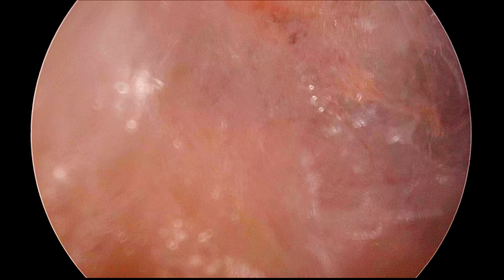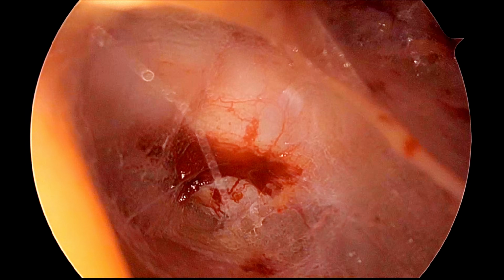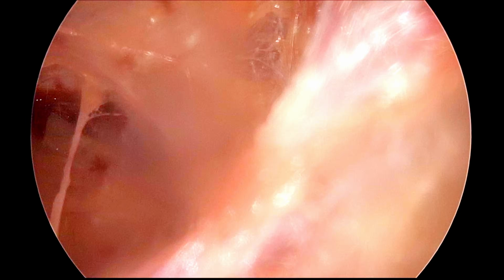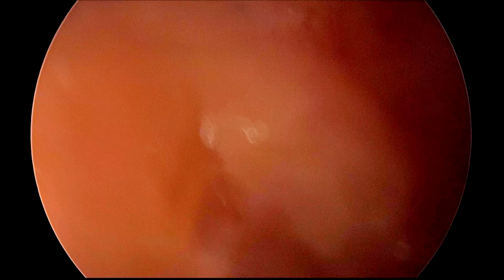Now we can see we have reached slowly up to the Cooper ligament, and then with the sweeping movement to the left you can extend a little bit, and then we will make a pocket towards the medial side also, to the midline, to introduce our two ipsilateral ports. Here we are using two ipsilateral ports and we will stand on the right side because it is a left hernia.